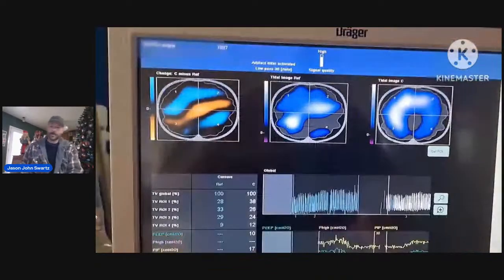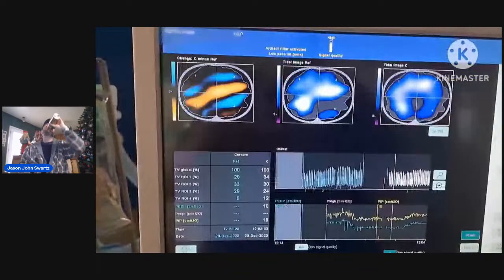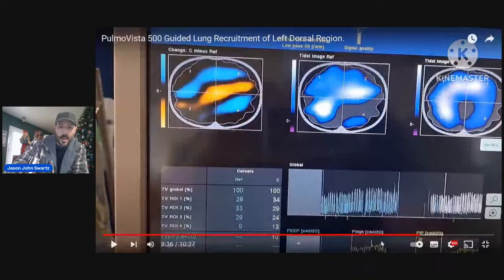And then after, we're at a PEEP of 10, and the PEEP of 10 is holding the region nicely open. We have 9, we're at 12%. The reason I said that it's holding is that I'm looking here and I see the impedance values after 10, and look, they're straight. If I was gaining end expiratory lung volume, meaning FRC, I'd see it going upwards. If I was losing with the PEEP of 10, you'd see this trending downward, meaning you're going to eventually lose that again.